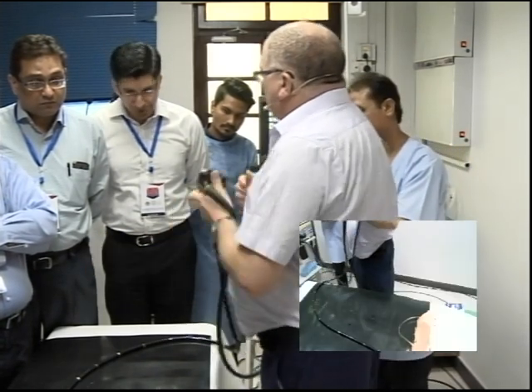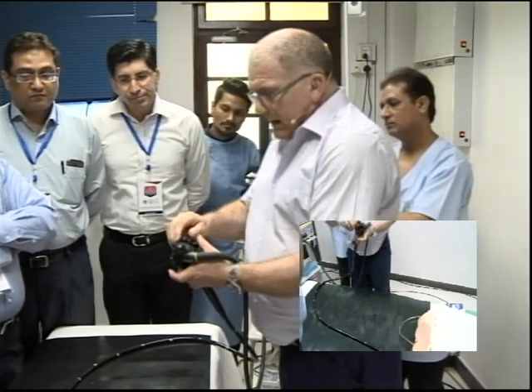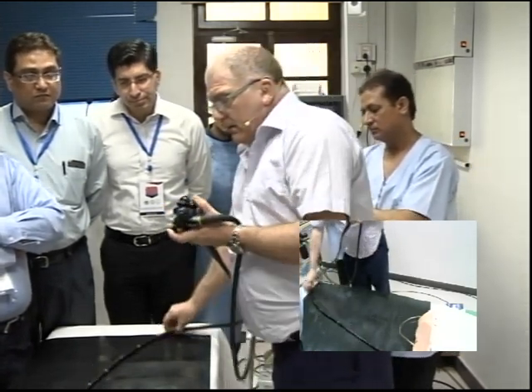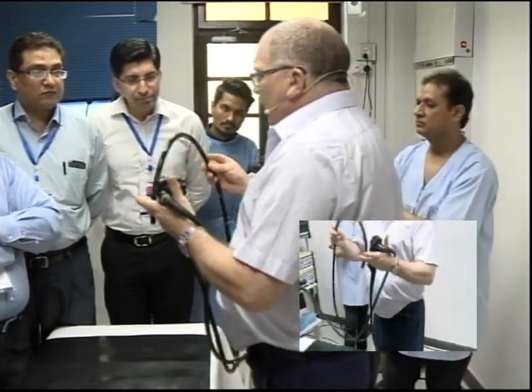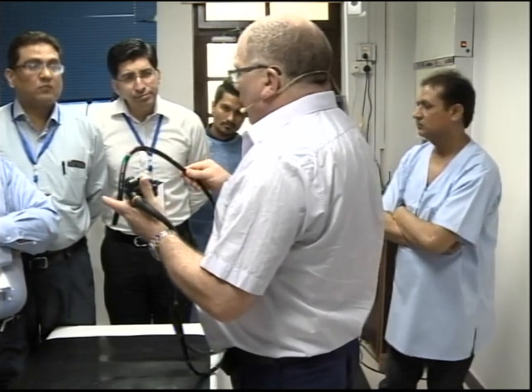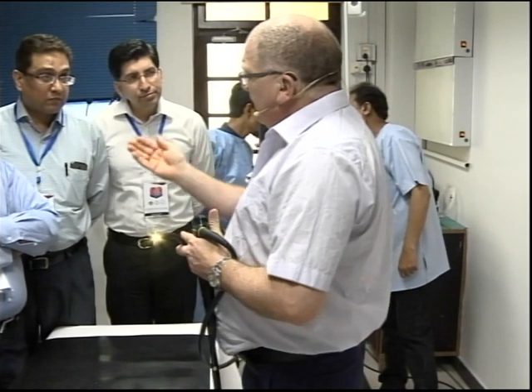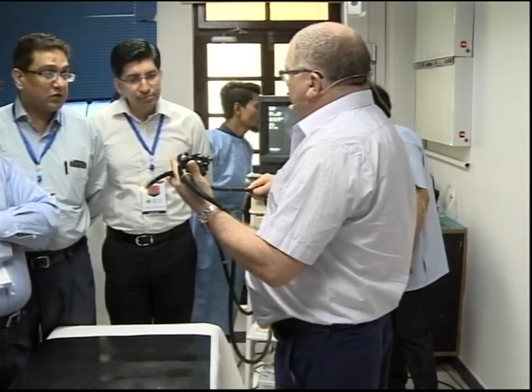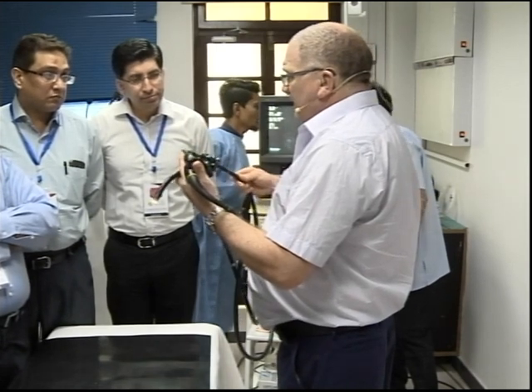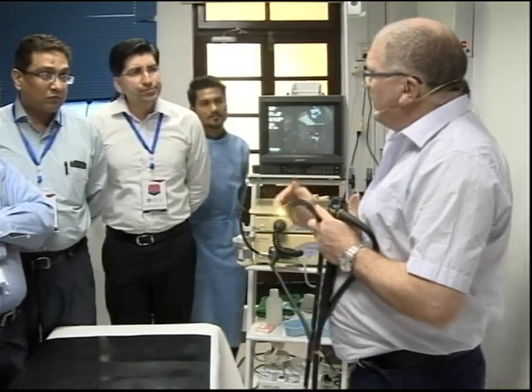What changes the tip is when I do this, do this, do this. So there's no point. What it does is it makes the tip of the scope rigid, and in making the tip rigid, you end up making it very firm to pass. When you're passing your scope, if you feel a little bit of rigidity, that's the wrong thing to do. Then you need to be aware of what you need to do opposite. The golden rule when advancing or withdrawing a scope is that on withdrawal you're feeling the path of least resistance. If that's resisting, it's this way you need to come when you withdraw it. So if it's getting a little bit firm to advance, you withdraw with the opposite torque, but slowly.